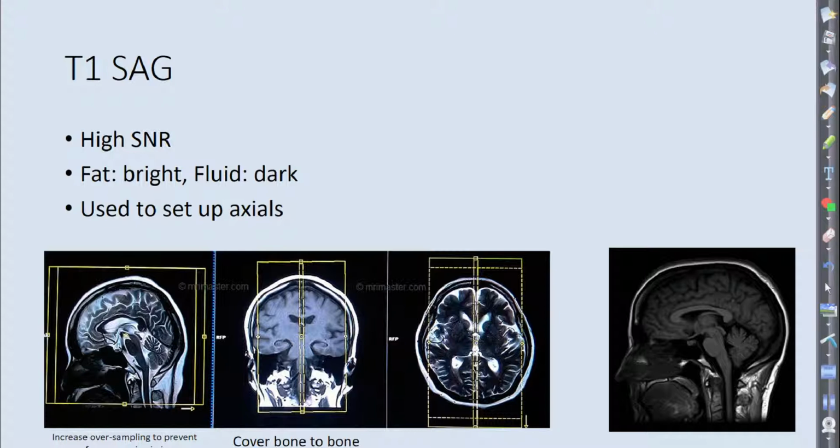What you said is called phase oversampling. What was the arrow again? Phase encoding direction. Because remember, that's the shorter axis of the anatomy. So in the sagittal, it's going A to P. And you can see it also, here's the arrow also. So always be mindful of those arrows.